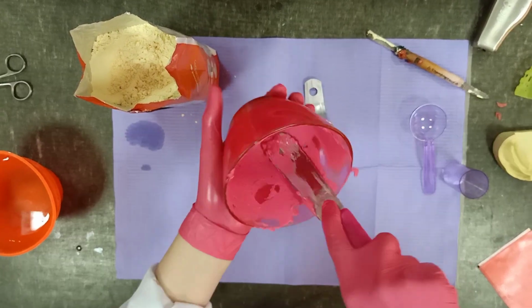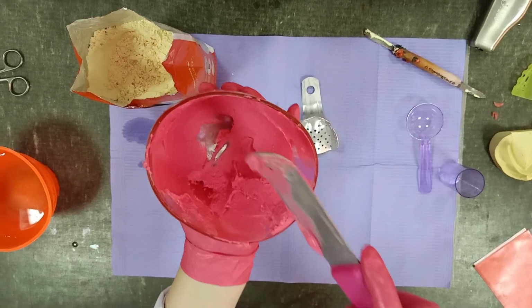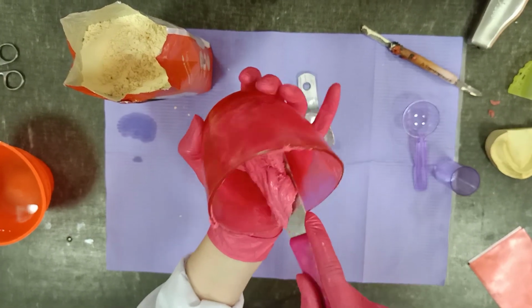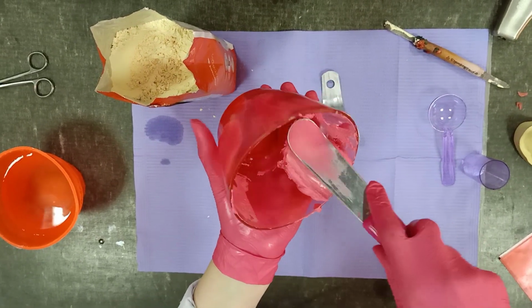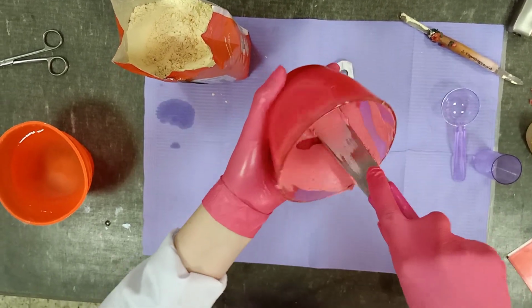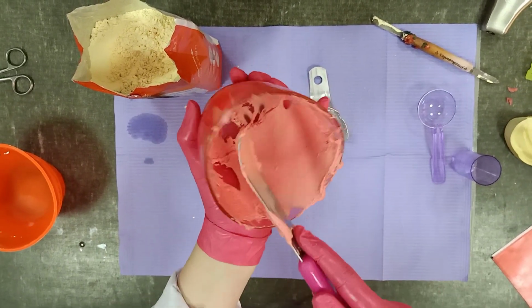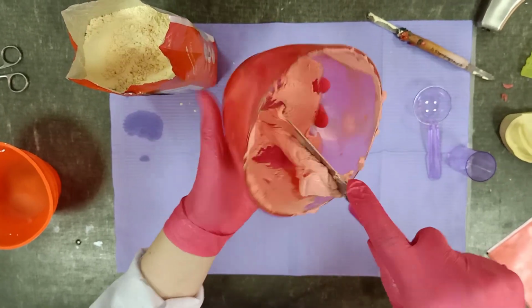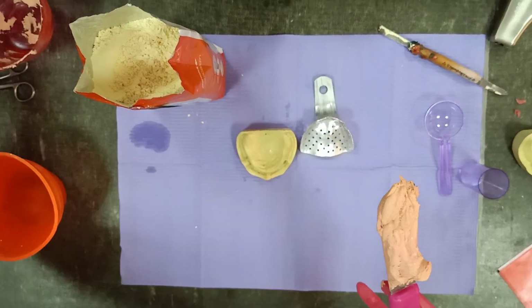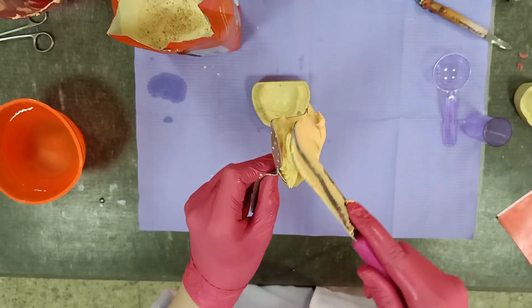Here, pressing all the alginate mix against the walls of the rubber bowl using your spatula so you can get a proper creamy mix without any air bubbles, smooth, and now it's turning into pale orange and is ready to be taken into 1 scoop, added in your stock tray.